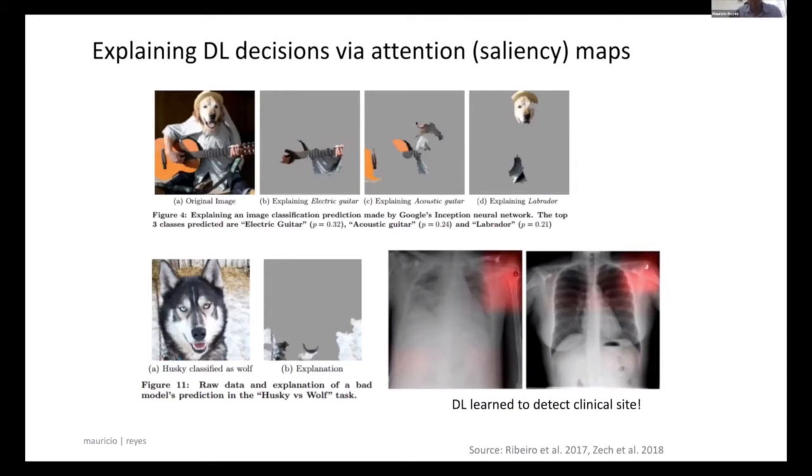Now, the problem is that without interpretability, you could have a lot of difficulties to understand that or to actually spot it. And that's where you could say, we need quality assurance, and we need to make sure the system is learning what it should be learning.